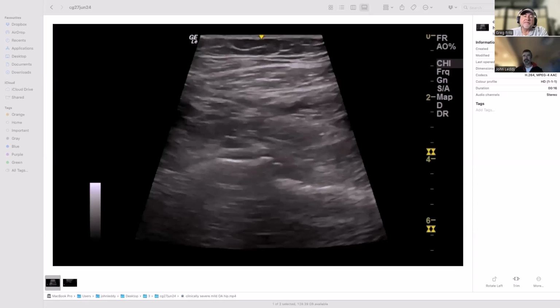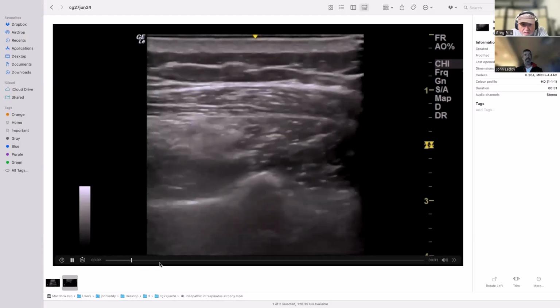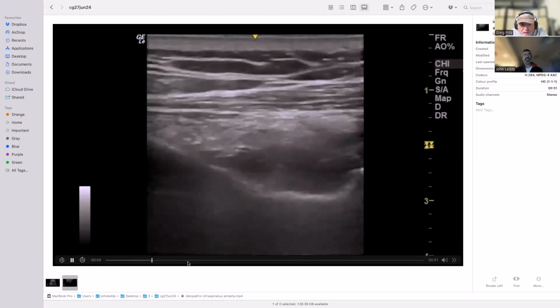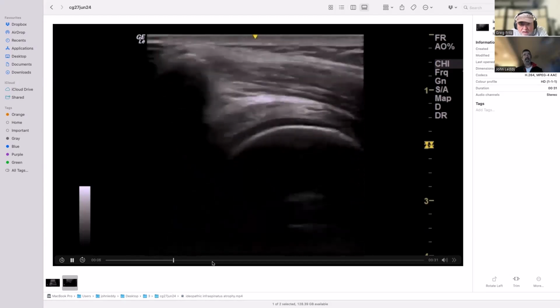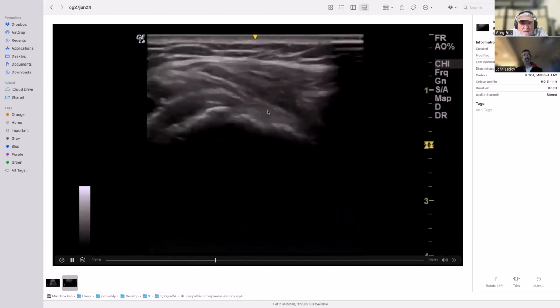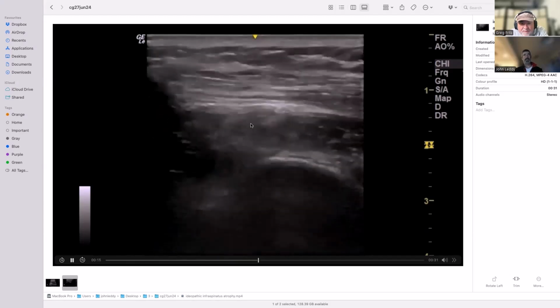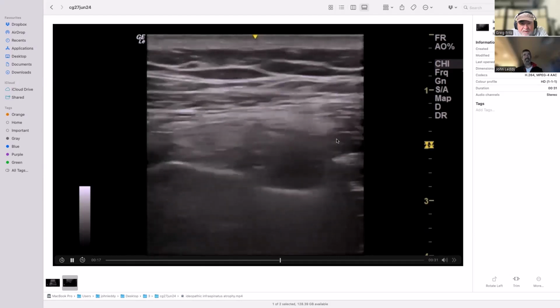Right. Yeah. I've got another hip, I think, lined up for you. Not now, but in a moment. Idiopathic. This is again something I've shown you times before, and I'm sure you see a fair amount of. But this is infraspinatus, looking a little bit moth-eaten. So the tendon is intact, but when we come out, the muscle is rubbish.